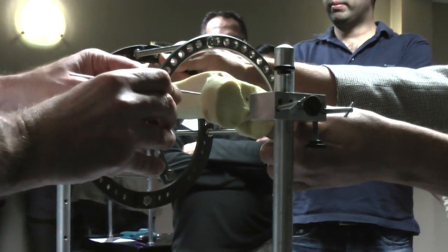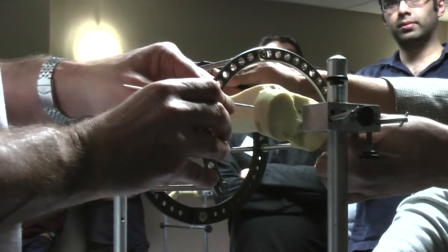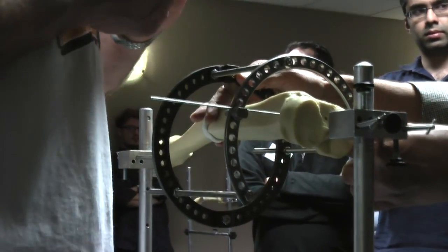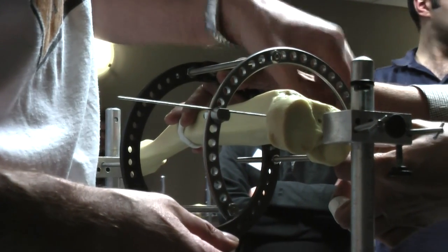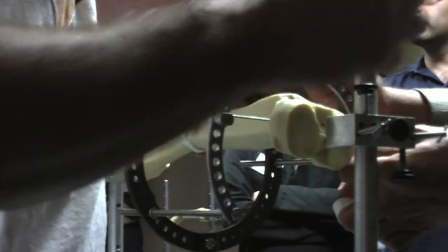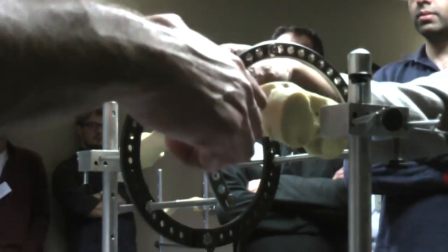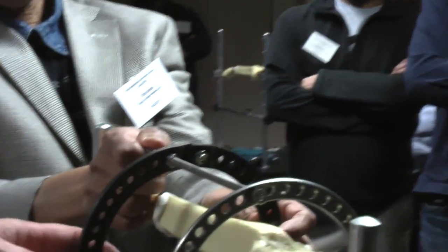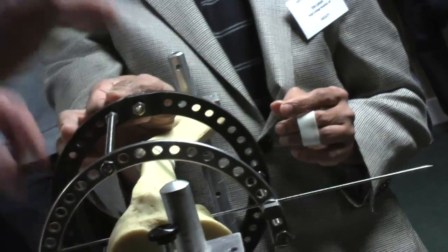And it doesn't matter how much time you spend doing this bit, because the proximal couple is what the entire frame is going to hang on after a little while. Okay. And just for now, I'll do those nuts up finger tight, because what you want to check is that your rod, the anterior rod you put in your frame, is exactly parallel to the tibia.